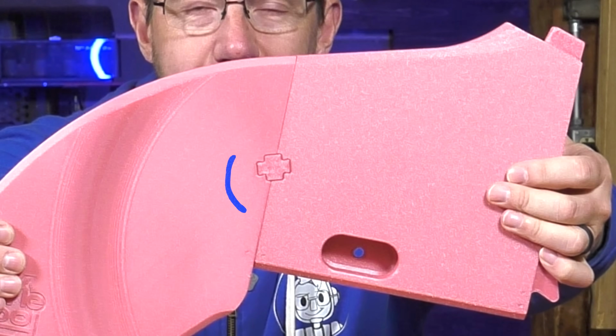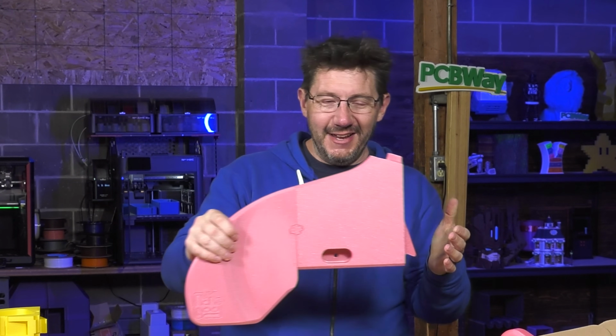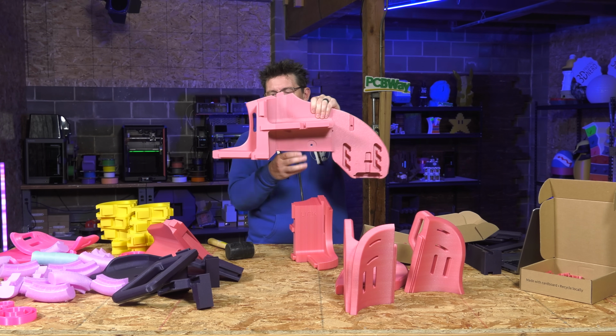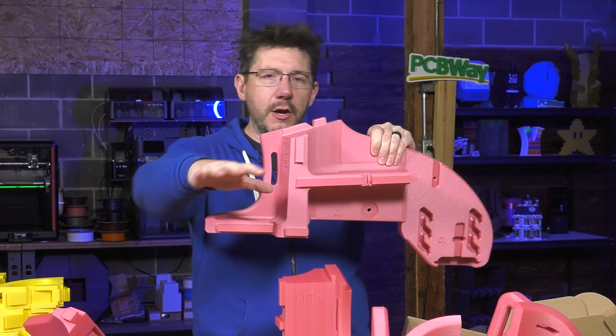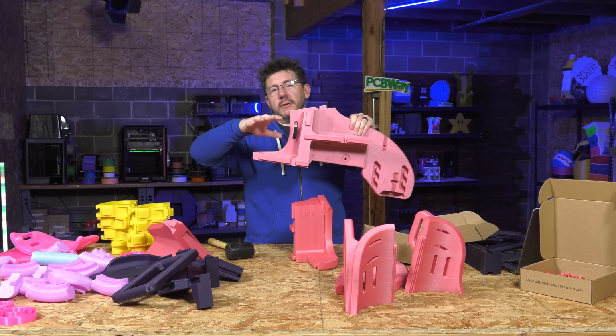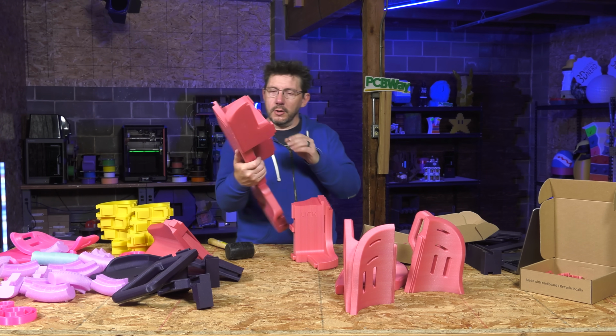Check that out. That's in, that's flush. And now these are held in really securely. It's such a good design. Genius. So if we're looking at this side, then this is that front, this is that piece we just attached. This piece is the back end. This is where you can put bags or oxygen tanks or whatever have you on the back of the TMT. That's going to go right here.